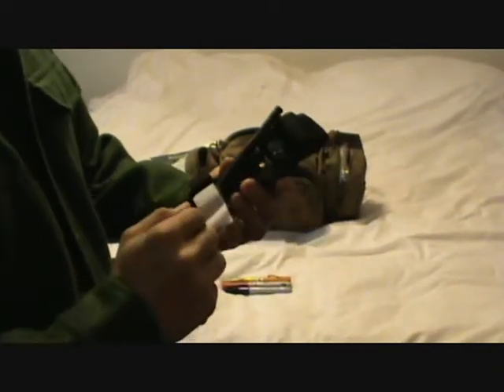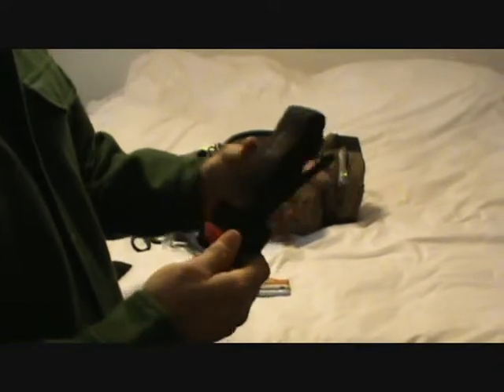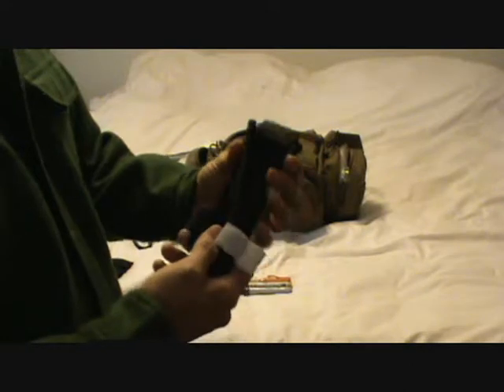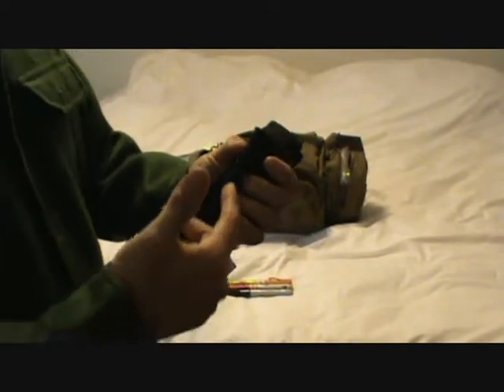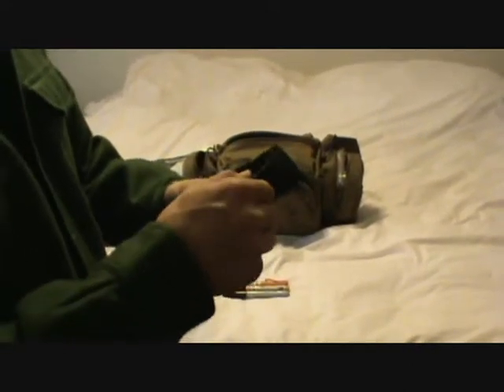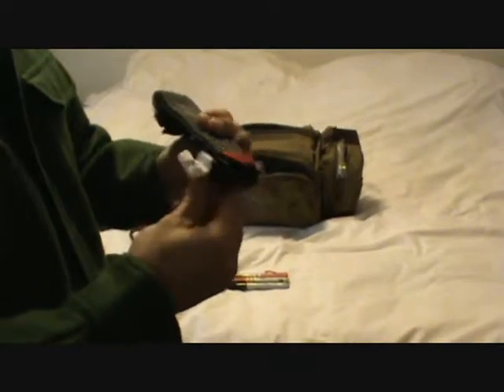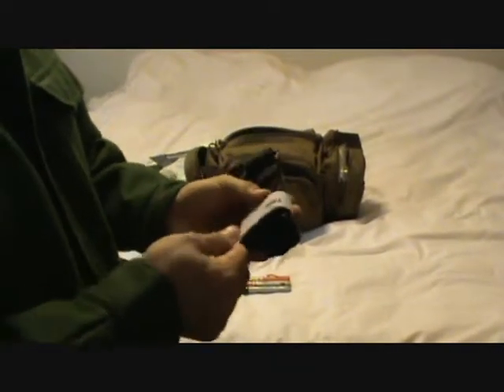Practice makes perfect, and if you have to apply one of these, you definitely want to know what you're doing. You can really hurt somebody, or you can actually injure them even more, whereas a tourniquet goes on, that you might do more damage. So you really want to know how to use a tourniquet. Great tourniquets. This is a military product that we use now.